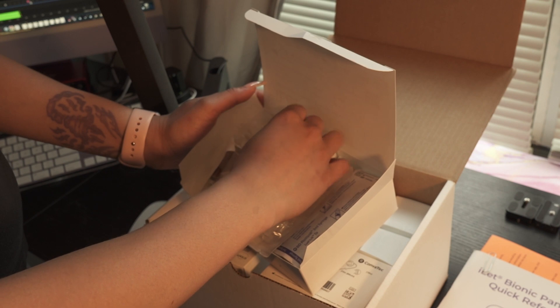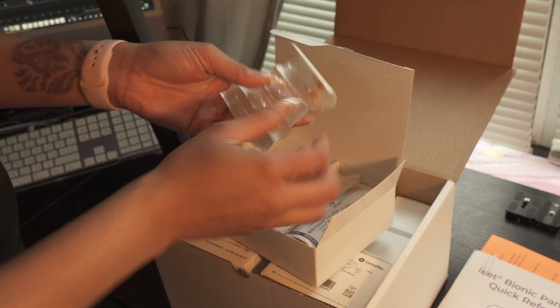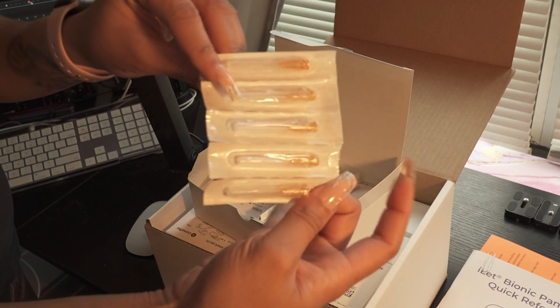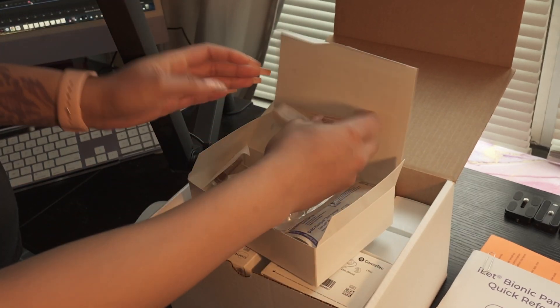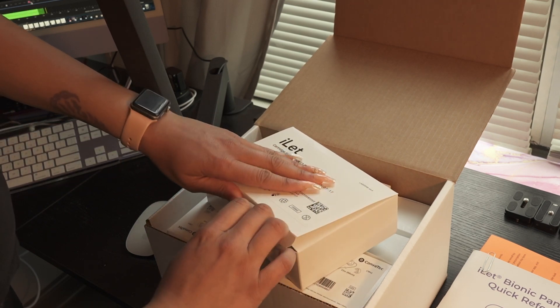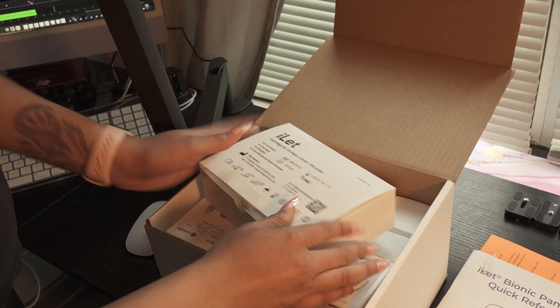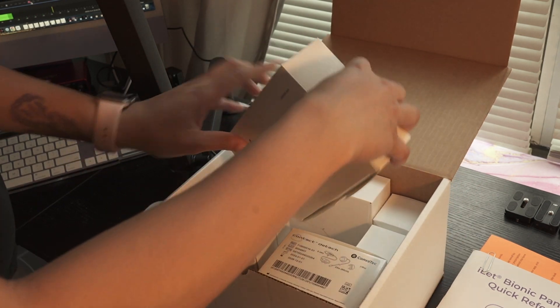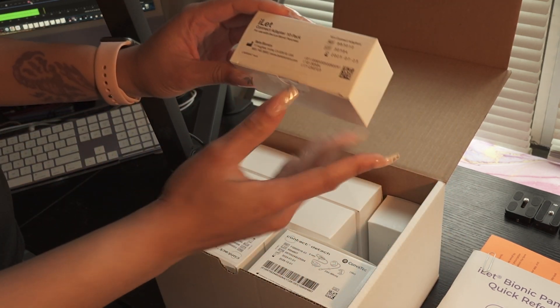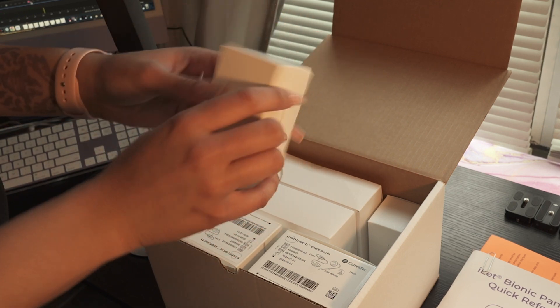And these are the needles. Oh lord — they're not that big, I thought they were. We got one final box for this unboxing video, and these are the adapters.